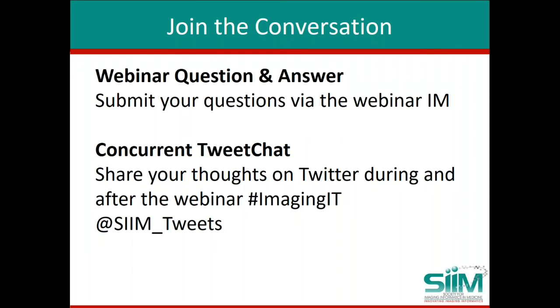Frederic? Yeah, if I got the question correctly, it was about integrating with dictation tools. Orthanc doesn't integrate with any particular dictation tool, as we're not a RIS, we're the DICOM server, and therefore we don't do any dictation integration. We do integrate with all the other systems, including RIS systems, so we can get the report that was dictated in another system, which is then the RIS.